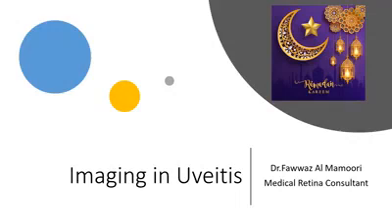In my presentation, I will summarize how to select the best imaging modality in each case of uveitis. And we will try to learn, at the end of this presentation, how we can select the best imaging approach for the cases of posterior uveitis.